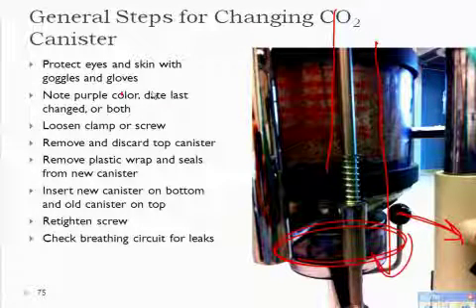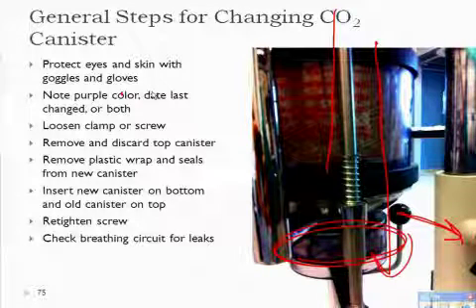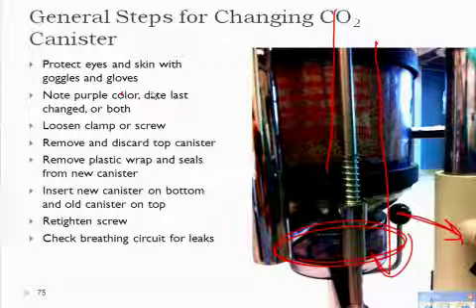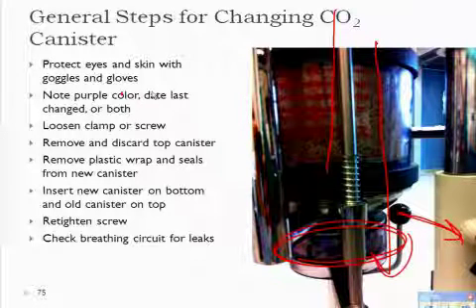All right? If the plastic's on, what happens to your circuit? It's a complete occlusion of the circuit. There is no air movement that can occur. Okay? So you must remove the plastic. Keep that in mind for simulation purposes.